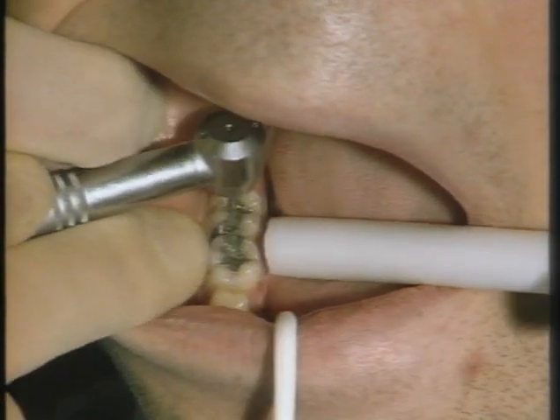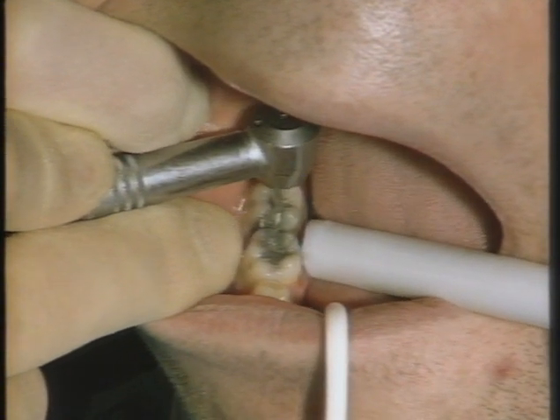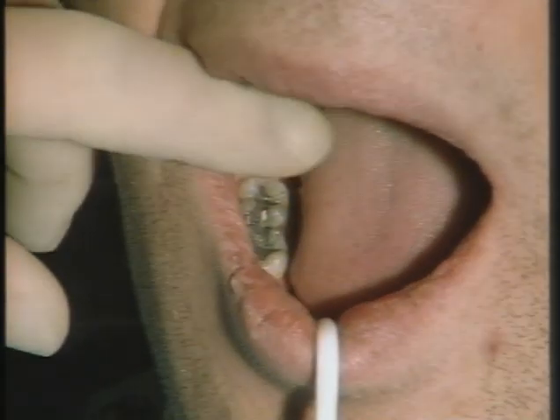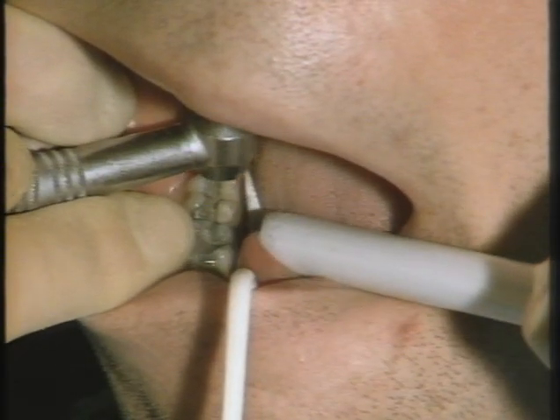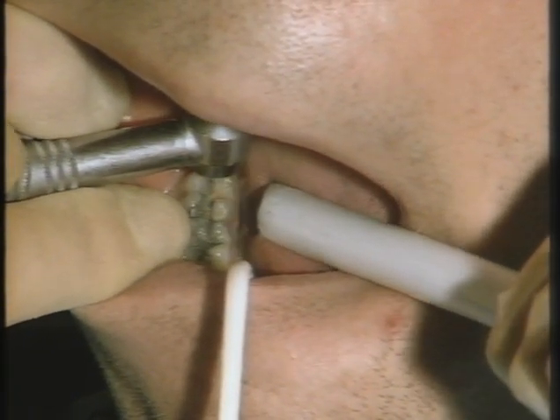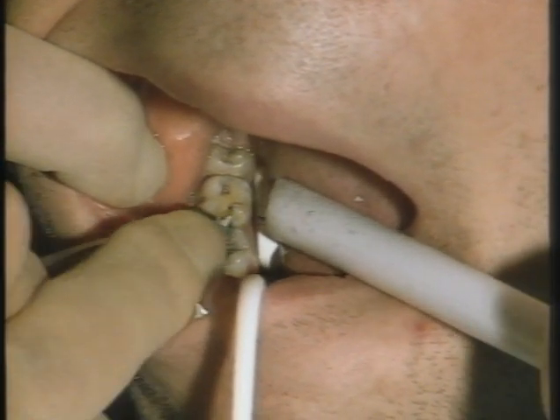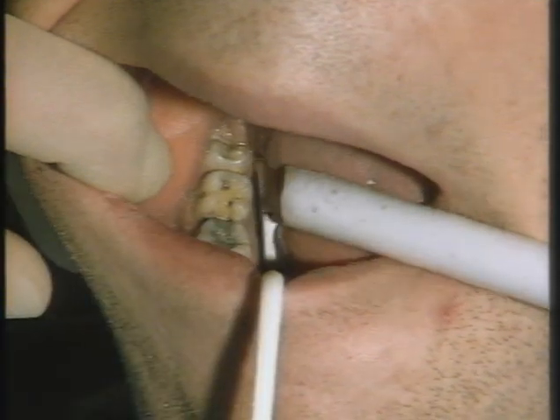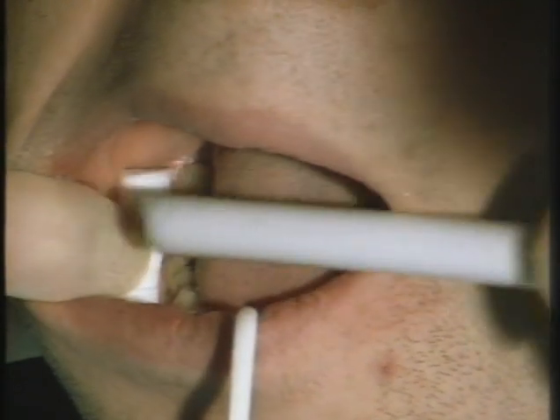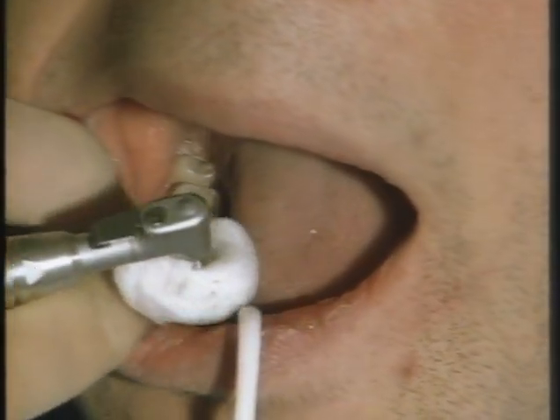This patient is to have an amalgam restoration in one of the lower molars. We can see that the only moisture control, of course, is through the aspirator there. We seem to have caught the tongue with the aspirator, and the tongue is rather trying to lie over the tooth. Of course, little bits of amalgam that flick out like that might go down the oropharynx. I see one landed on the lip. Oh, whoops. Patients don't like that very much. I suppose that's happened to all of us from time to time.